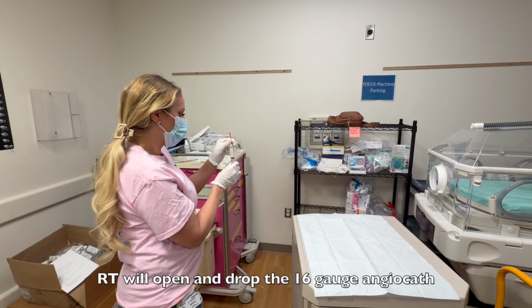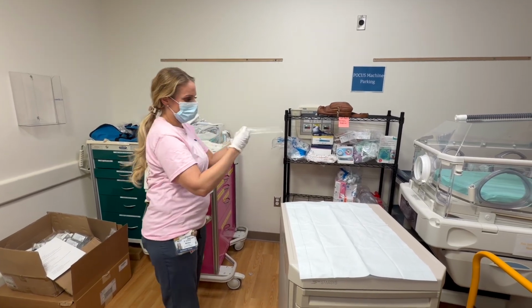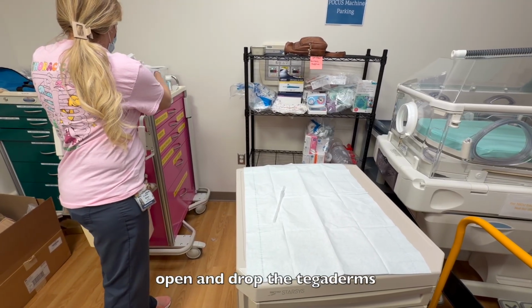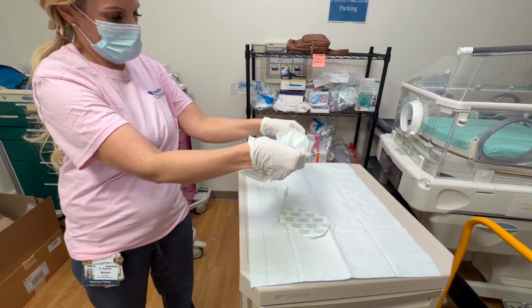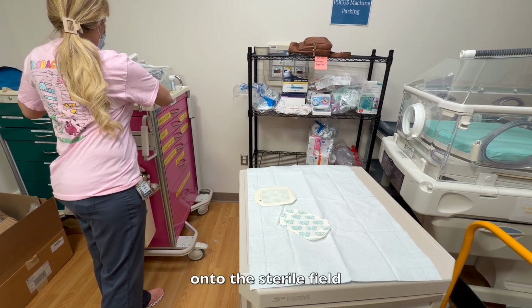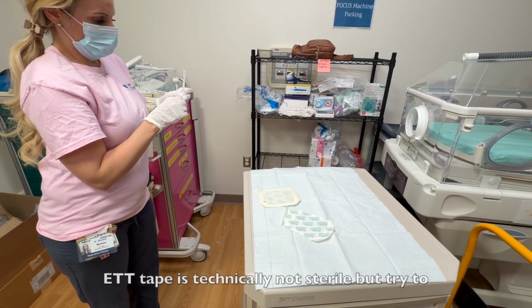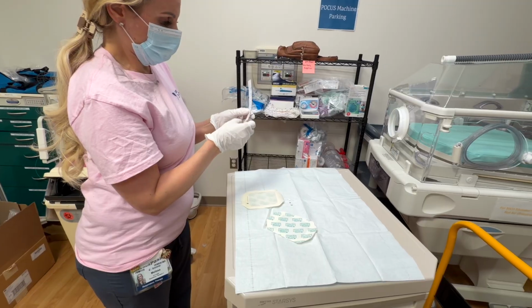RT will open and drop the 16-gauge angiocath, open and drop the tegaderms, and drop the pre-cut tape measure and the pre-cut ET tube tape onto the sterile field. ET tube tape is technically not sterile, but try to maintain as much sterility as possible on the rest of the field.